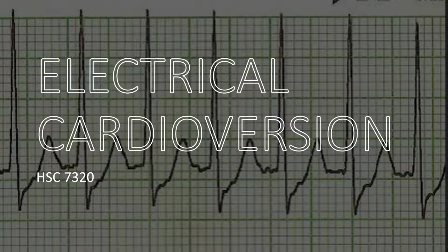The mechanism of action for electrocardioversion is the same as for defibrillation. What we're trying to do is provide sufficient current through the myocardium to simultaneously depolarize the majority of all the cardiac cells. Now, this is going to include the cells that are involved in perhaps a re-entry circuit or an excited anomalous pacemaker. The ensuing repolarization should also occur simultaneously, and it should follow the normal pattern, allowing an atrial pacemaker to become ascendant.